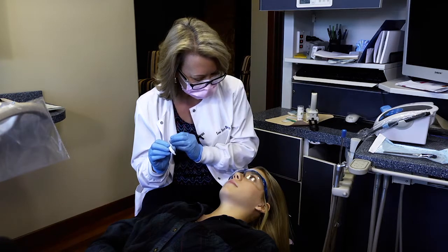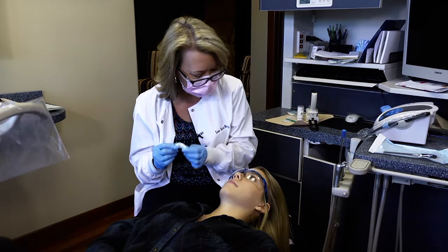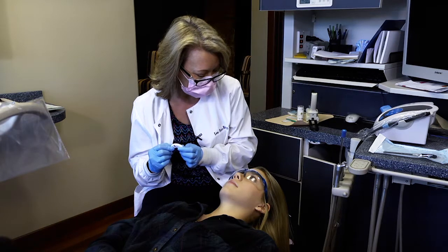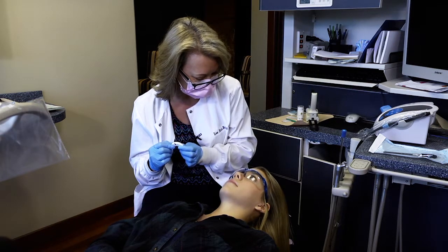It's a little bit gooey when I first put it in. It doesn't have a bad taste. And then I'm going to put this over your teeth. I'm going to ask you again to sort of gently bite together for me, and then we're going to hold that. This material actually sets relatively quickly, but we're going to leave it on your teeth until it gets to a hard set. Okay? Okay.